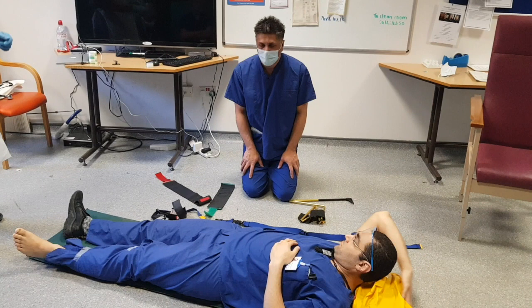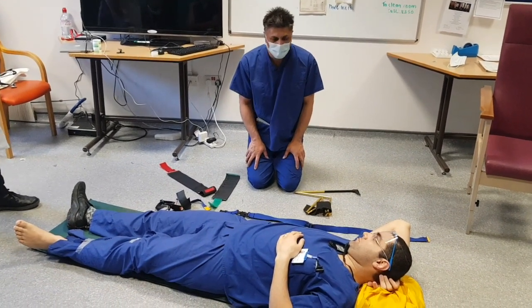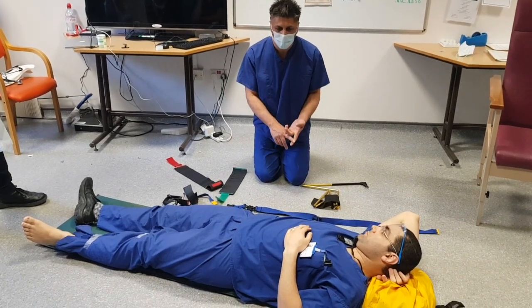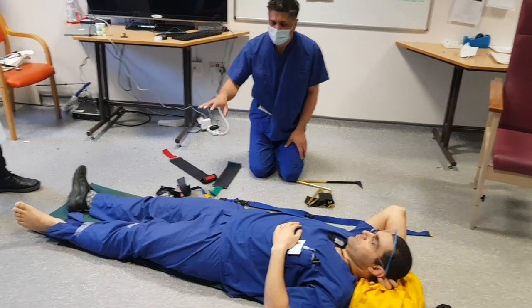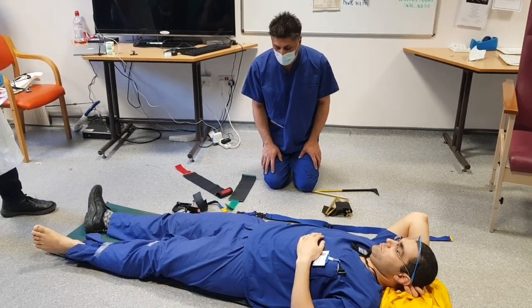In this demonstration, we're going to apply a Kendrick Traction splint to Korean's leg. A, B and C are all fine. He's had a femoral nerve block to help him with pain and it's an isolated injury. We're going to check his neurovascular status before we start and then check that we've got all the equipment that we need.